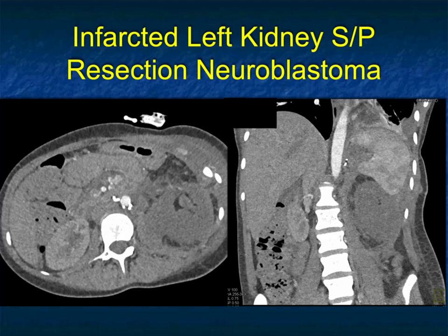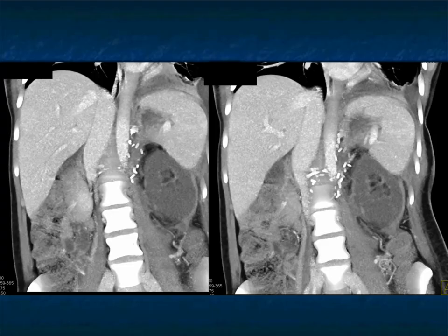That was one of the more unusual cases — bilateral global infarctions are not common. In this case, a patient who had a resection of a neuroblastoma developed flank pain post-op. The right kidney has good cortical medullary interface, but the left kidney shows lack of enhancement — global infarction. In the venous phase it stands out better, with a little capsular flow to the edge. The renal artery was injured at the time of adrenalectomy — a known complication — and this kidney will be removed because flow will not return. This is nicely accentuated on cinematic rendering.